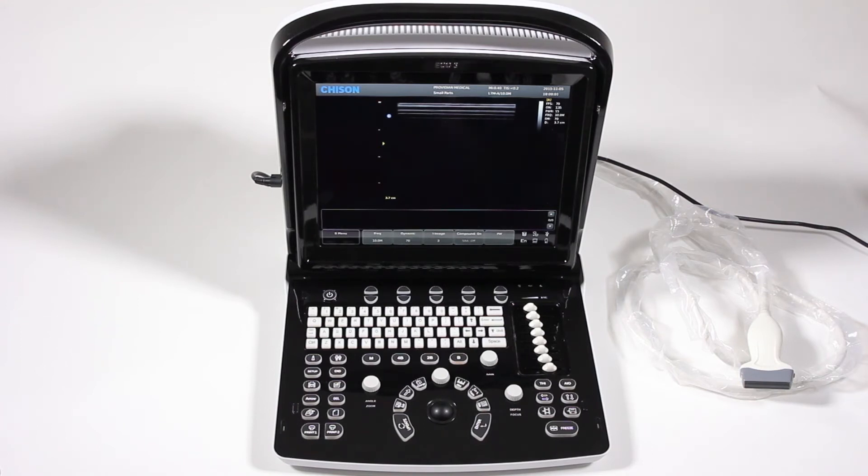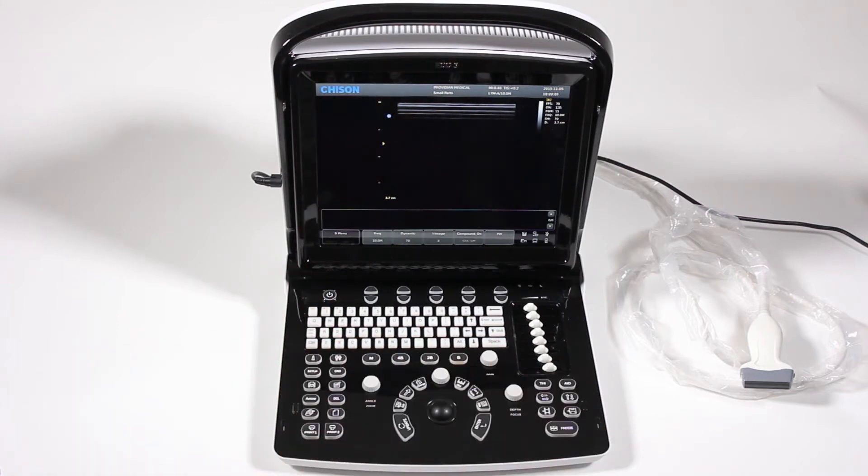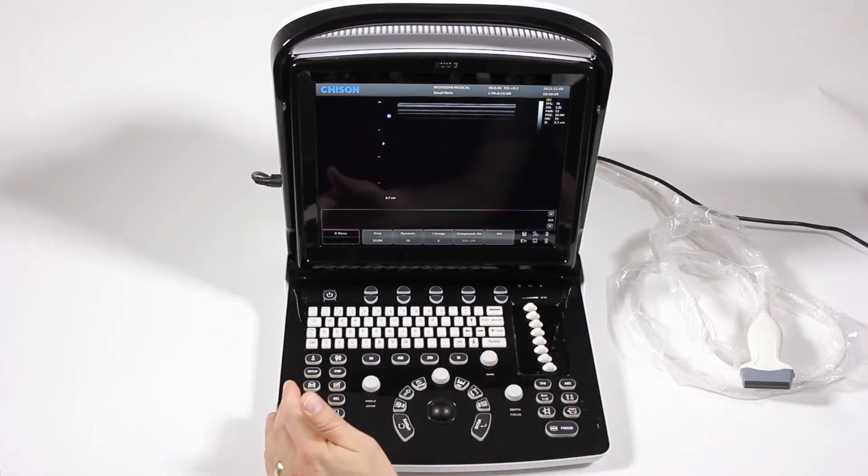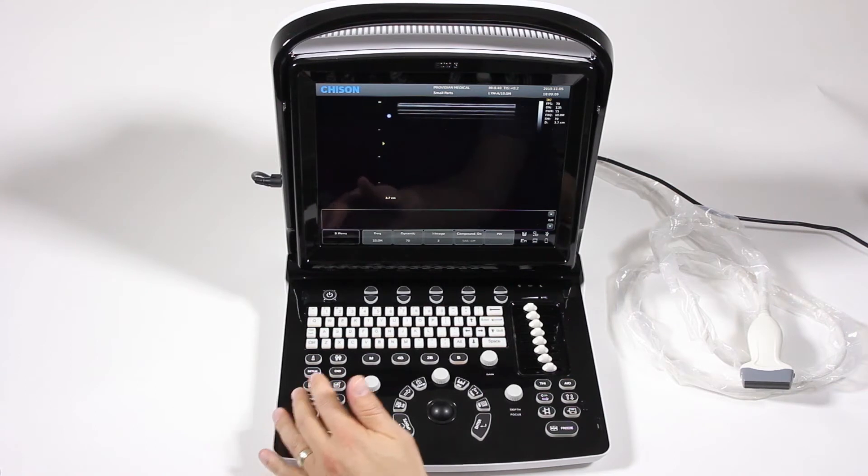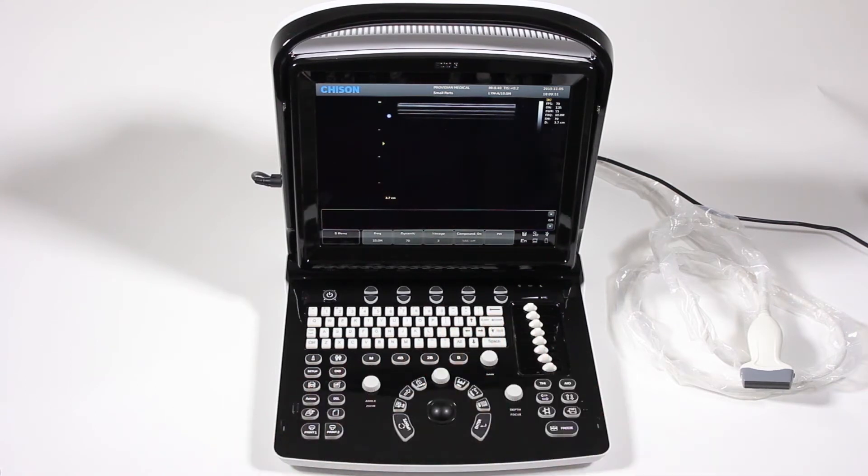Knowing that, let's just go around the user interface. Obviously, we found the power button, which will turn the machine on. It's a standard QWERTY keyboard. Nothing terribly strange about it, but we'll get into the patient information screen.